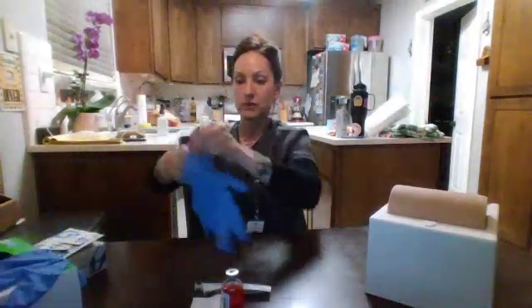Now, when I deliver this medication, you may experience a burning or a stinging sensation. That's not from the medication, that's just from the injection. So before we begin, do you have any questions for me? No, you don't? Okay, so let's go ahead and get started. I'm going to perform hand hygiene and then I'm going to put on some clean gloves.